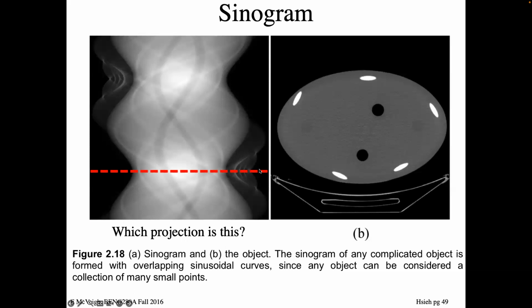There are certain features you look at to work this out. If I'm projecting down from the top to the bottom and my detector's in this orientation, then the data I see will be quite wide, right? So when I'm projecting vertically, either from the bottom to the top or the top to the bottom, I'm probably out here, because it's where this gets the widest.